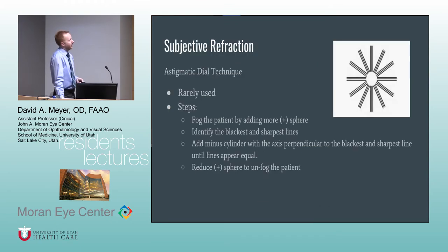All right, so we had a fun discussion about this yesterday. This is called the astigmatic dial technique. I'm kind of starting to get into a few other things, how to start finding the amount of astigmatism.